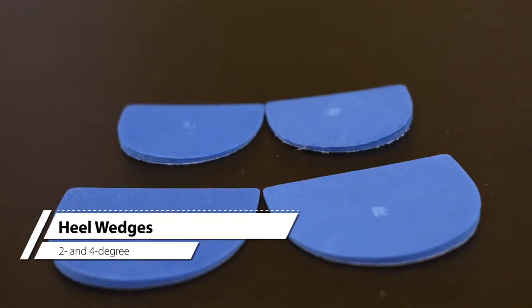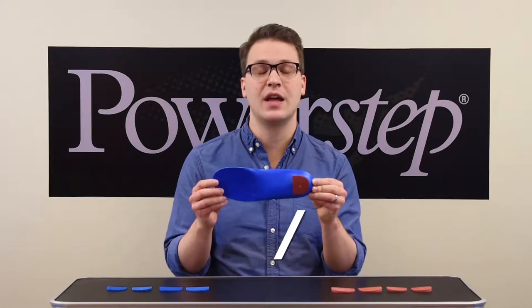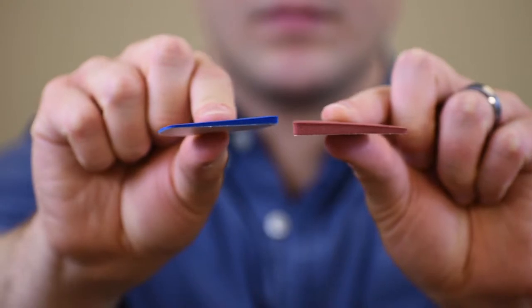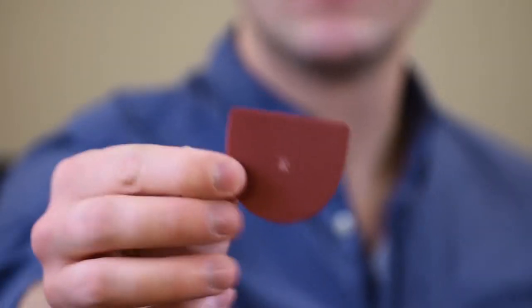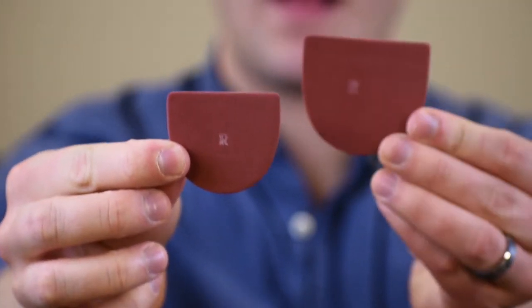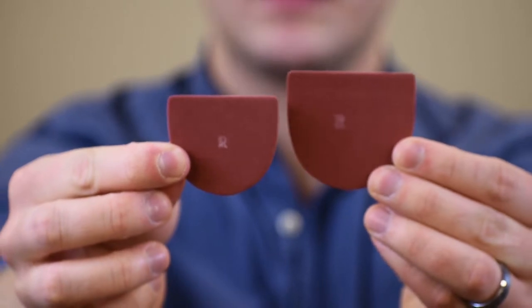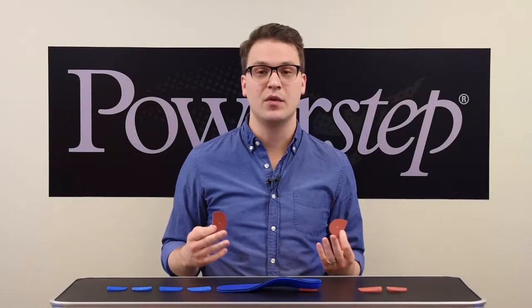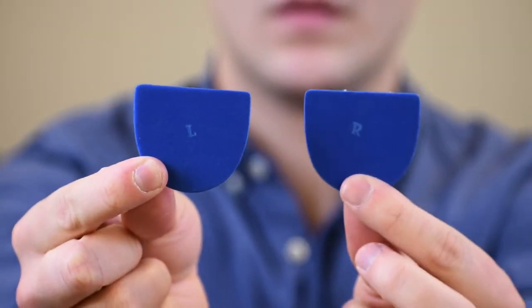Heel wedges are designed to correct pronation and improve foot alignment to alter joint load. We have two different heel wedges: a 2 degree and a 4 degree wedge. Each comes in two sizes — small for most women's sizes and regular for most men's sizes. These are designated for use as the medial wedge, marked left and right accordingly.